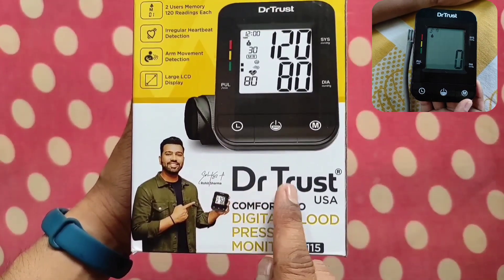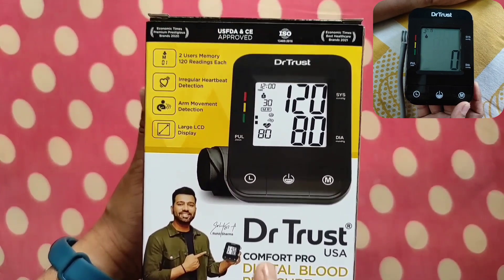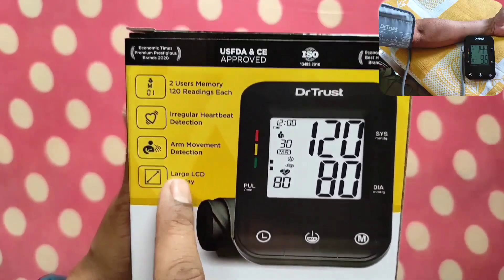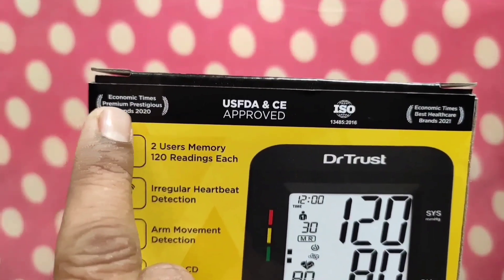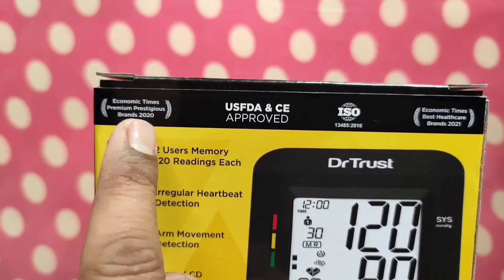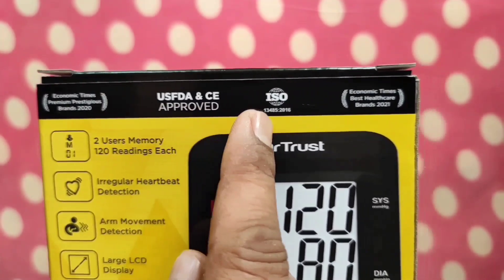This is the quick unboxing and review of the Dr.Trust Comfort Pro Digital Blood Pressure Monitor 115. I have purchased this product due to its unique highlighted features, which I will tell you one by one. Dr.Trust has been selected as the premium prestigious brand of 2020 by Economic Times, and it is also approved by US FDA and CE.